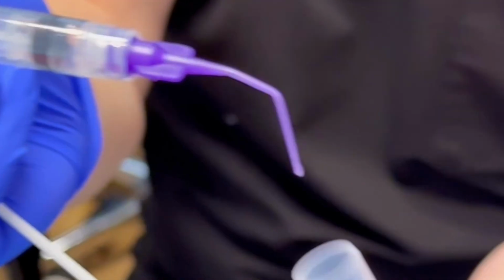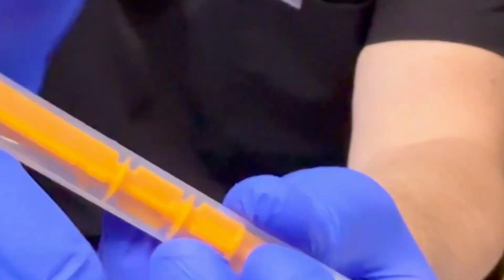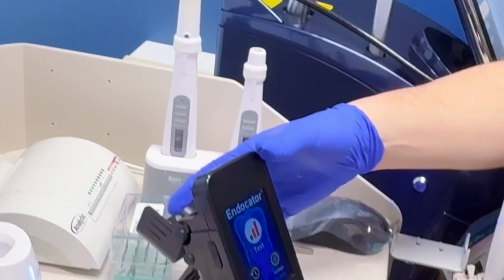Sure. The down and dirty version is it's a chairside tool that allows us to measure how clean our canals really are. That's a very distilled version of it. To elaborate more, it's a chairside assay that we use to detect debris inside the canal. It detects ATP, so any living type of cell that's internal, whether it's bacteria, pulp tissue, blood.